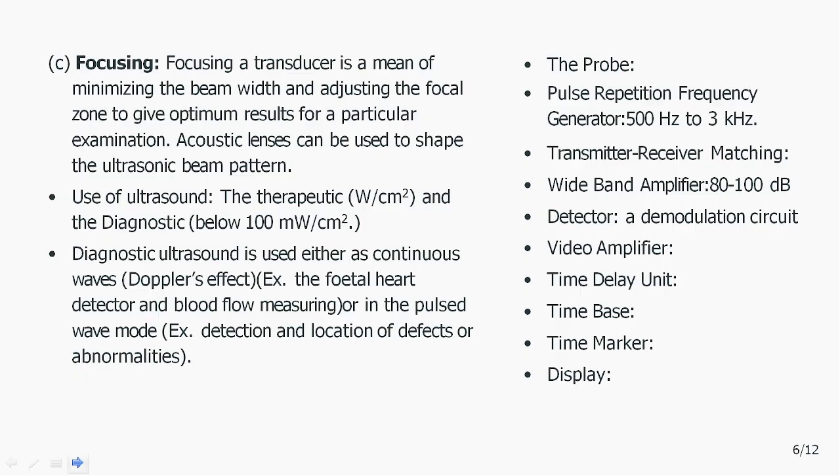Then the prominent blocks of this ultrasonography machine. The first one is a probe, which contains your piezoelectric transducer.